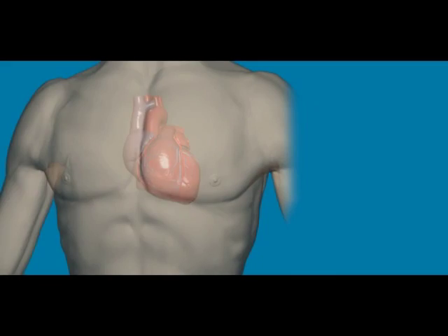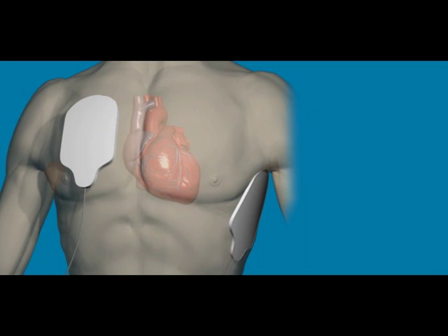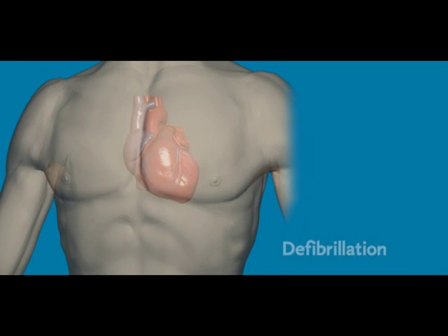The longer they stay in this condition, the lower the chances are that they can be revived. The only way to stop ventricular fibrillation is with a controlled shock to cause the heart to restart in a regular rhythm. That's called defibrillation. Defibrillation is most likely to succeed if the patient is shocked within about the first 4 minutes after collapse.